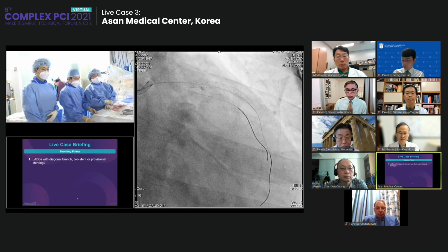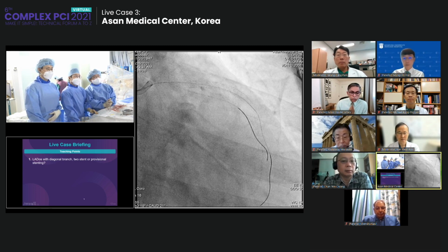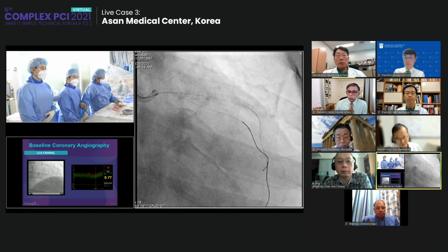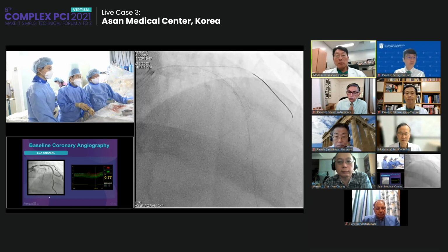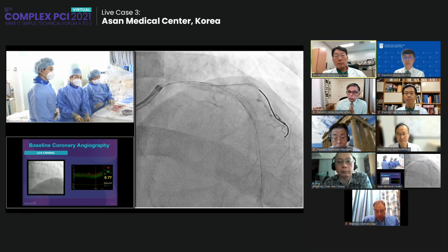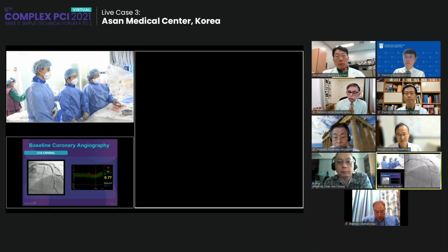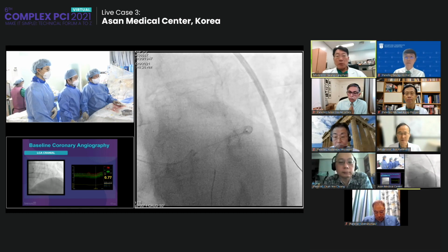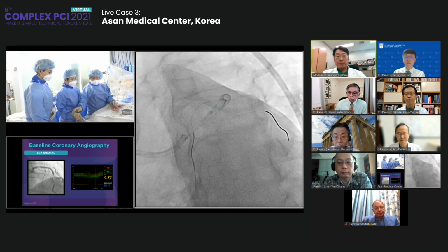So, Professor Han, can you continue? Thank you very much for a very nice introduction. Do you have any question or comment on the patient? Would you show us the angiogram first? Yeah. All right. You took an angio, right? This is the wire only. All right, great. So the circumflex artery is a separate one, right? Yeah, right. So this is basically LAD disease, LAD and combined diagonal branches. However, angiographically, it looks like a left main disease.